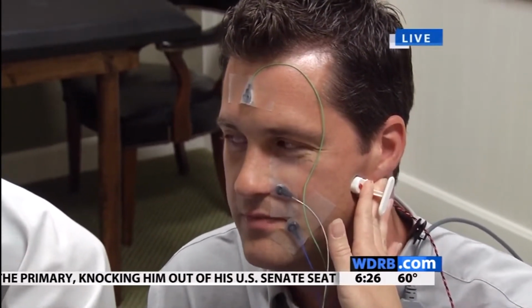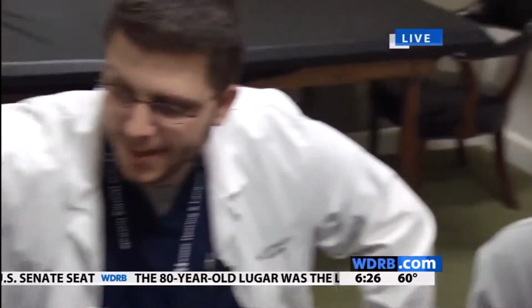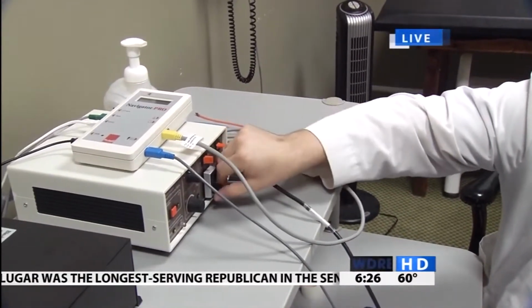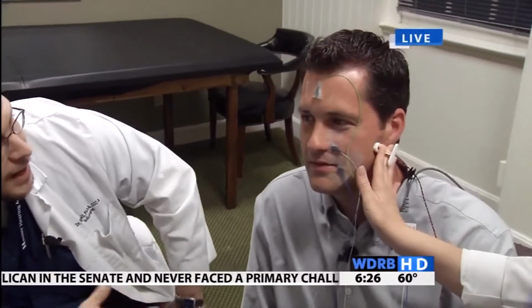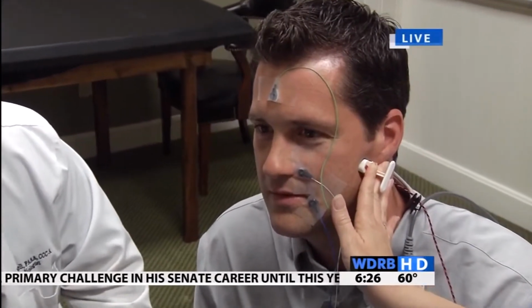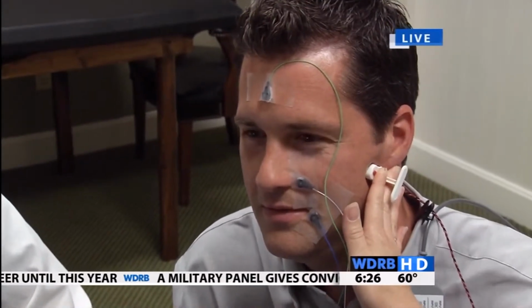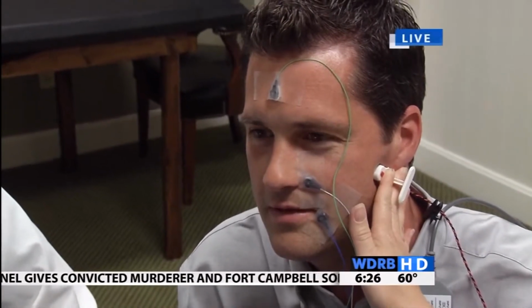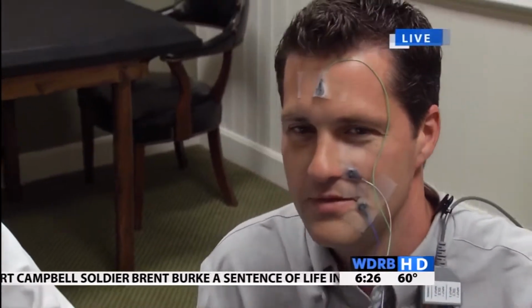All right, so that was six quick bursts. Six quick bursts. All right, so we try it again. Should we crank it? Yeah, we'll go to 40. So this is the maximum. And why would we want to crank this up? Well, you want to get the maximal response from the nerve, so when you compare left to the right, you're comparing apples to apples. All right. Let's see what happens here with the six. Here we go. Okay. It was reacting the way we wanted it to react. So that's good for the audio impulses. Fantastic. Thank you. You're welcome.